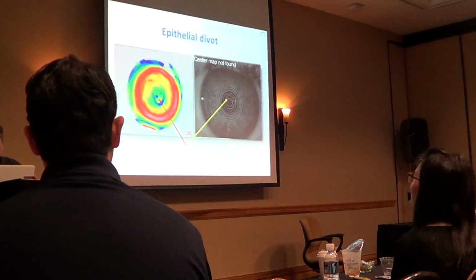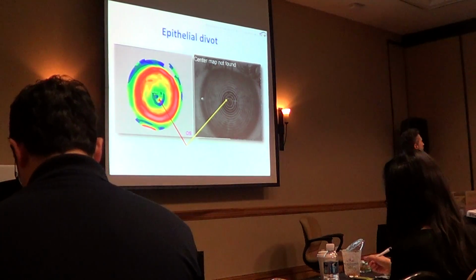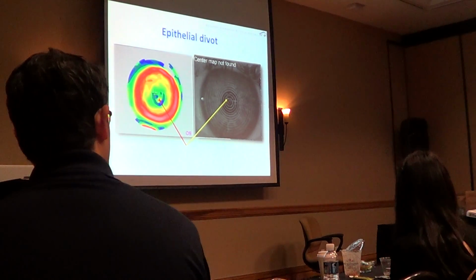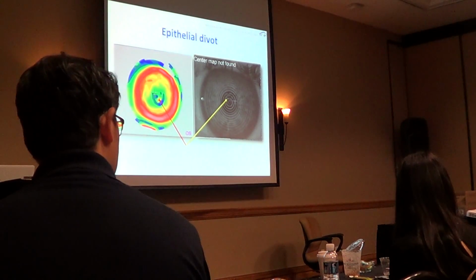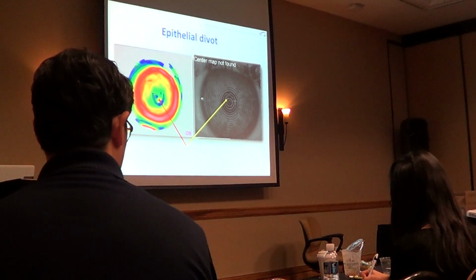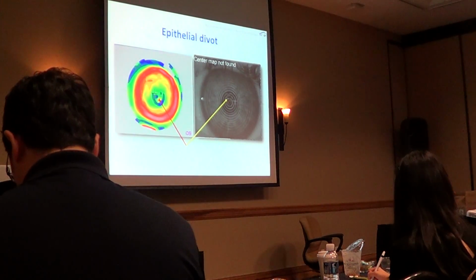What did you use to change the sagittal height, which curves? The easy way is to change everything. The easy way, in order not to think so much, you change every curve by a quarter diopter. That's the easy way. That is 14 microns. The not so easy way, you change every small piece of the lens to obtain what you want.